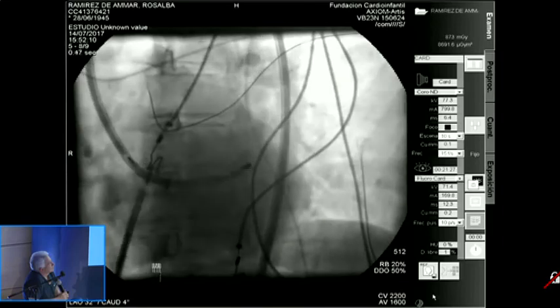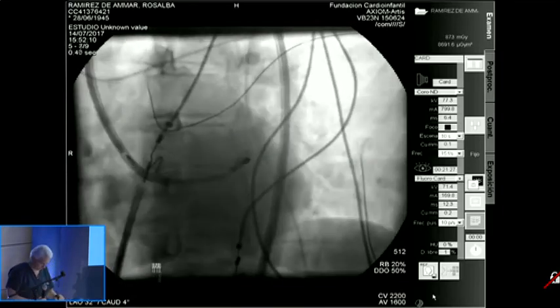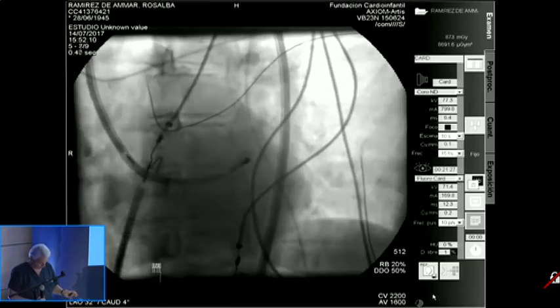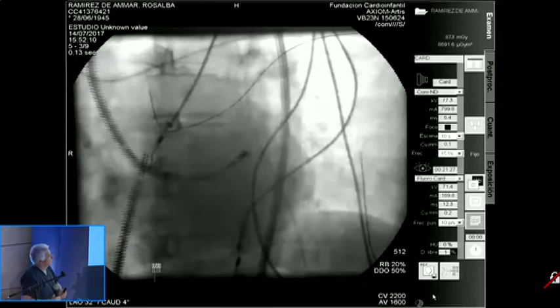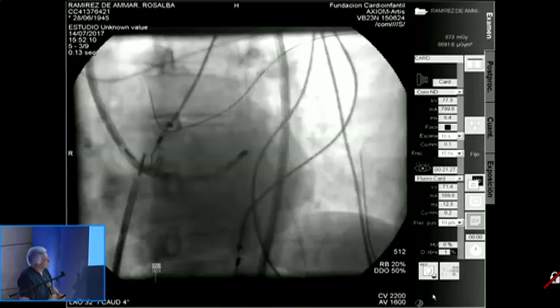So we're going to show the electrograms, or when we did the ablation and the mapping and the maps. Navics and electrograms, please. The last ablation and Navics, please. Precision.